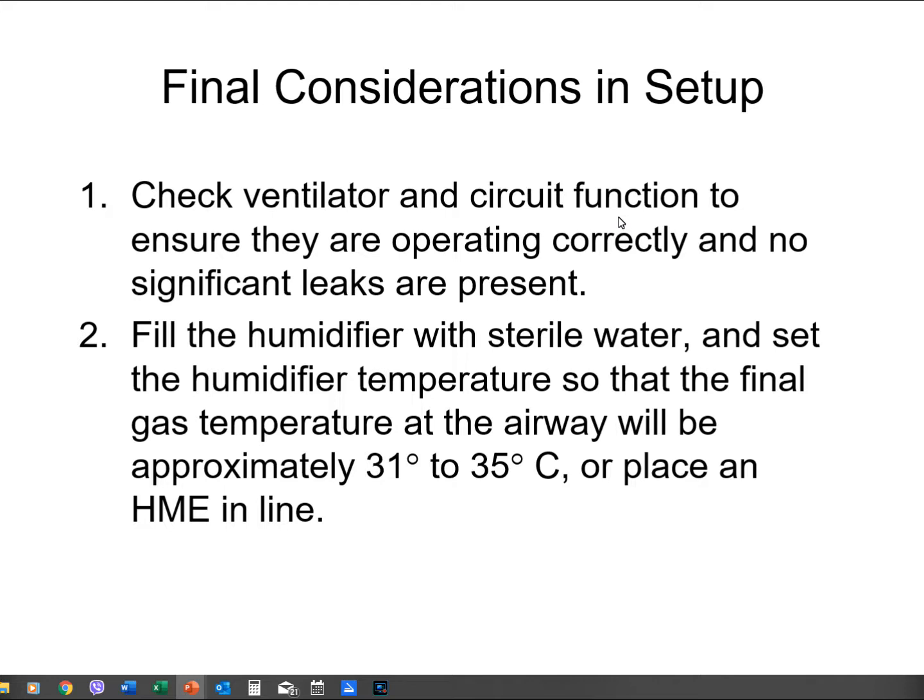Okay. And then also, you want to make sure that the humidifier is used with sterile water. Okay, and you don't want to store water on top of the vent, even though at my old hospital we did, because it was so convenient. We had our clipboards for our vent checks on top of the vent, and then we had bottles of sterile water on top of it. Well, we got dinged because that's water on top of an electrical machine. So we had to put the water at bedside. All right, so you want to make sure you use sterile water. Don't use sink water. Don't use dirty water. Again, that's going into the lungs, which is sterile.